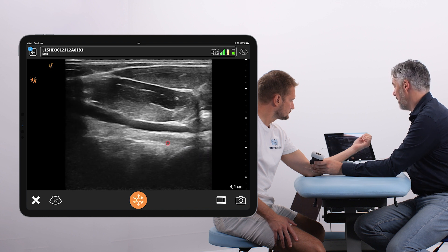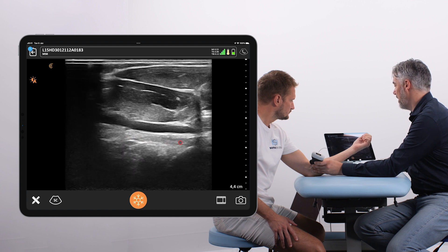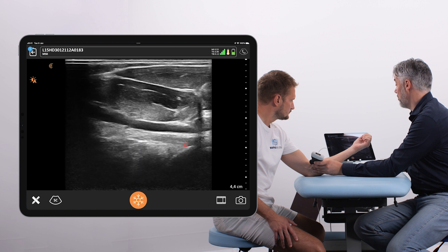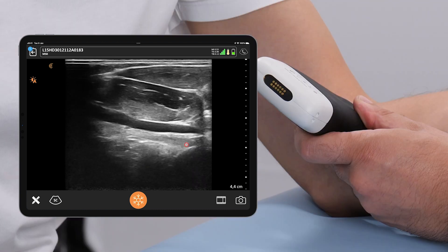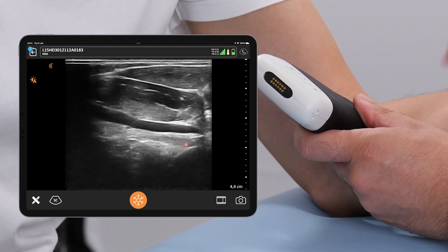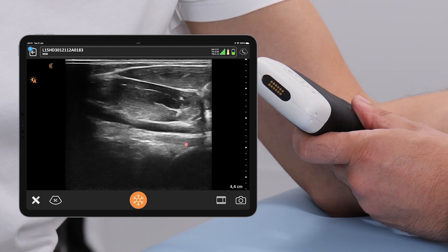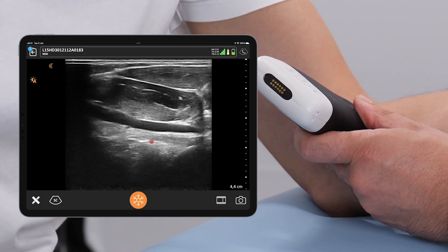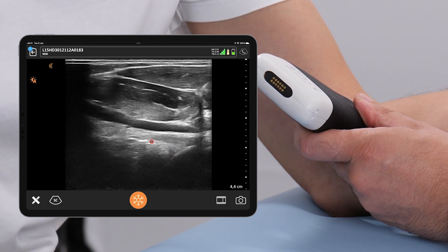Try to keep the biceps tendon a little bit more horizontal on the screen to avoid anisotropy and to increase the echogenicity. To do so, tip the distal transducer tip a little bit more into the skin. This was the fourth and last approach to scan the distal bicep tendon.